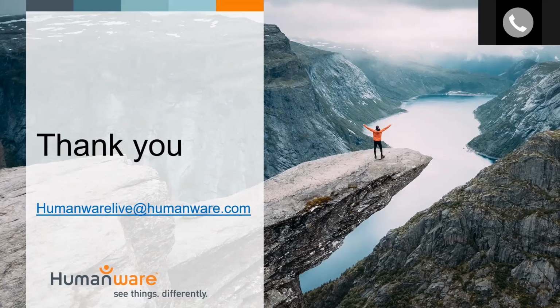Absolutely. My name is Jim, and I want to tell you, without belaboring the point, that I have attended many webinars, mostly for competitor products, and you guys presented an awesome hour and 10-minute seminar. It was complex, it was detailed, but your descriptive detail was phenomenal and over the top, and I would have sent it in an email, but I had to tell you, I think you guys just did an incredibly good job. Thank you. Well, thank you so much, Thanks, Jim.